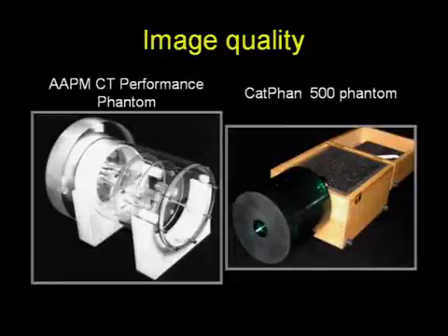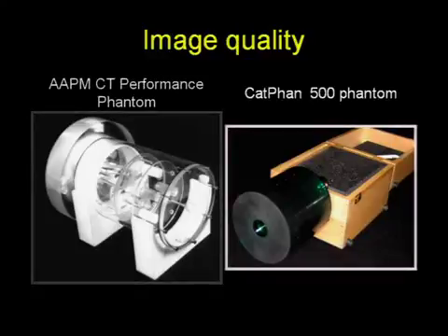So again, all of these parameters can be acquired and analyzed using commercial phantoms that are out in the field. And in this talk, I'll be focusing on the CT CatPhan 500 phantom just because I'm more familiar with it. But anything off the shelf will do.